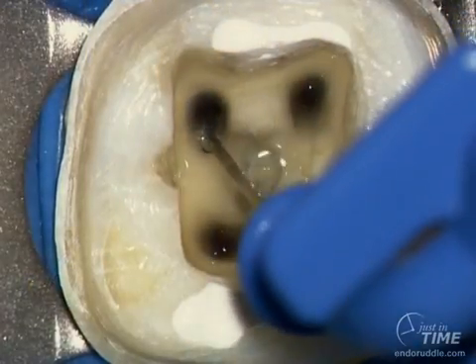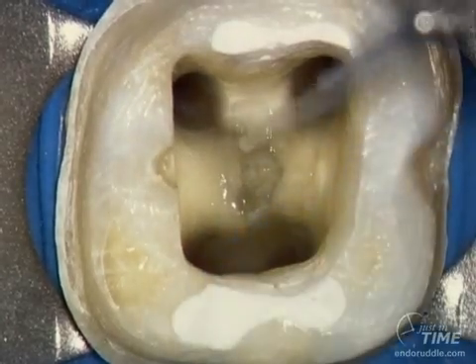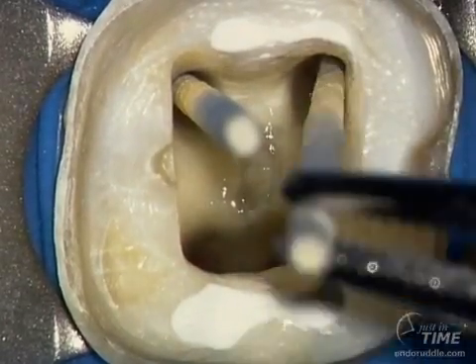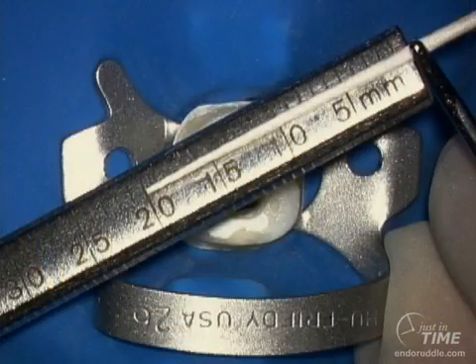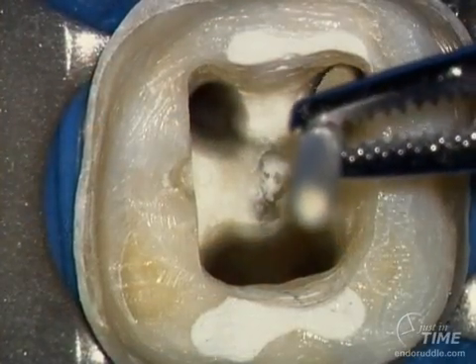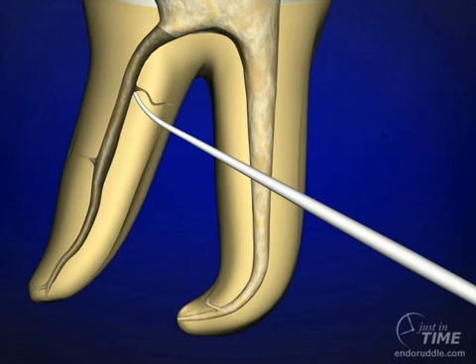We can use an irrigating syringe to vacuum out the bulk of the reagent that's inside the mesial systems. Paper points are used to do the final drying and to length. Let the paper points sit momentarily in the canal so that they can wick up surplus moisture. The paper point can be set a little bit longer just to see if the drying point can be extended.